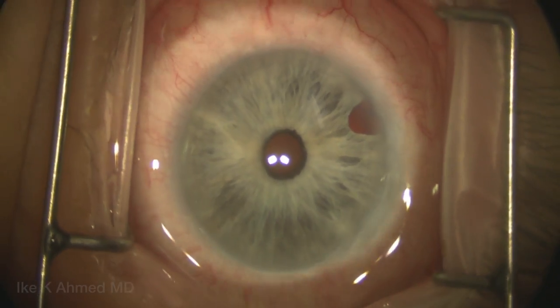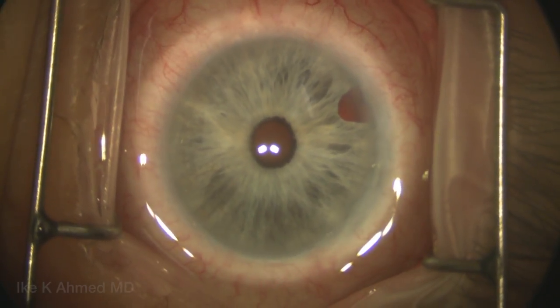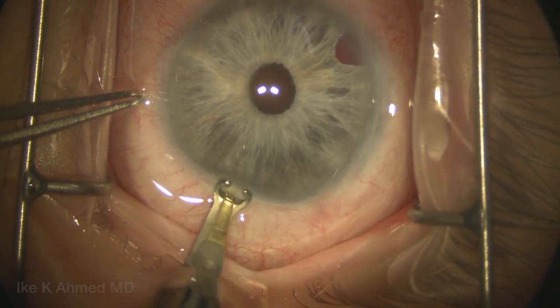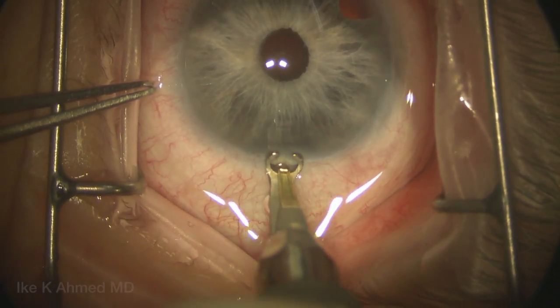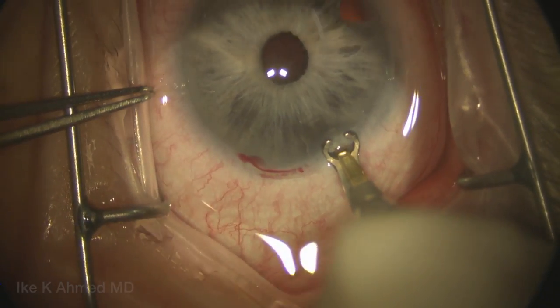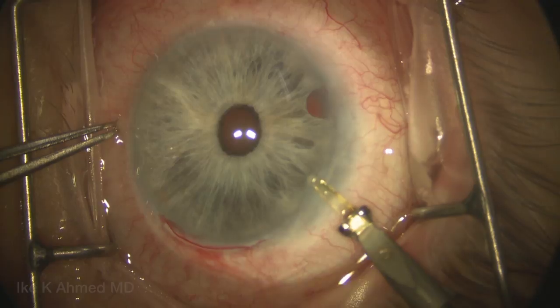This video demonstrates the implantation of the Artisan aphakic lens. In this case, we're going to make a temporal incision, or one may make the incision over the steep axis. This is a 300-micron groove, 6mm in length, placed temporally at the limbal area, holding the eye here by the conjunctiva.